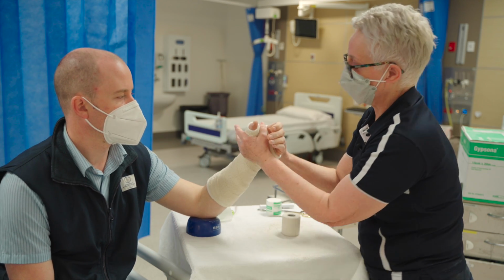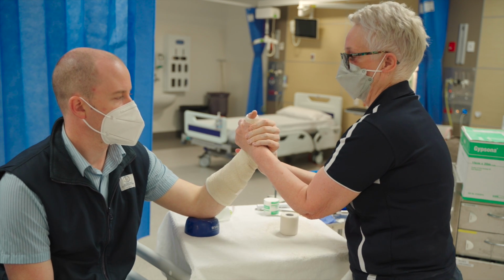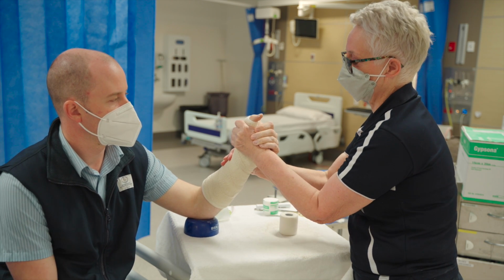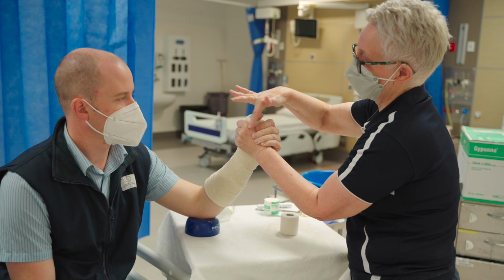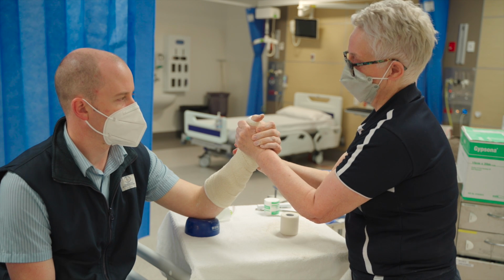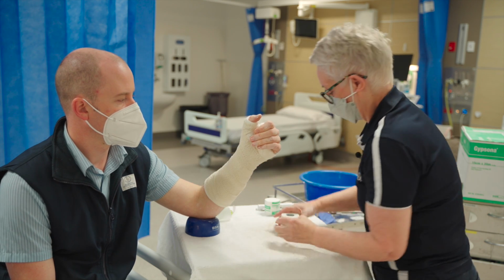Now just do a quick check for your moulding. So your moulding is what we call a biker's grip. So we want to make sure that that wrist is back. So you might need to push with the back of your hand to make sure that wrist is cocked back. And what you're doing is actually moulding around the base of the thumb and in between the index finger and the thumb. So we get the patient to keep their hand there like so.